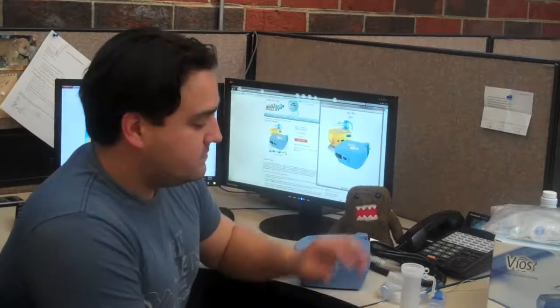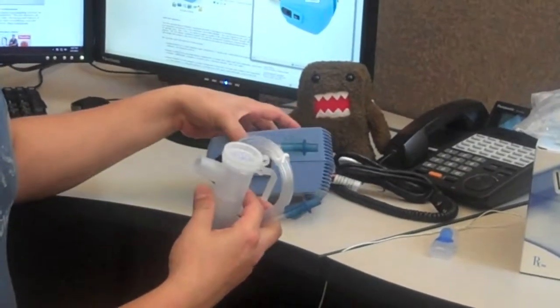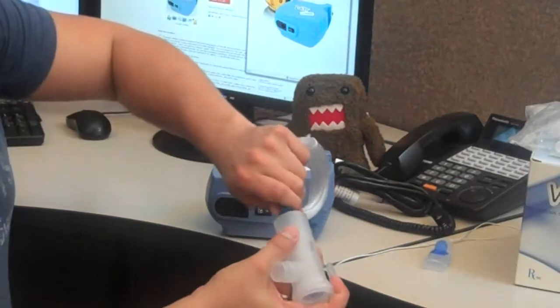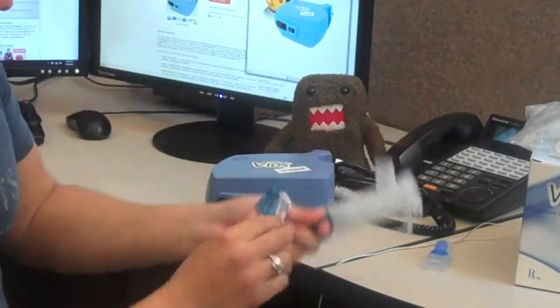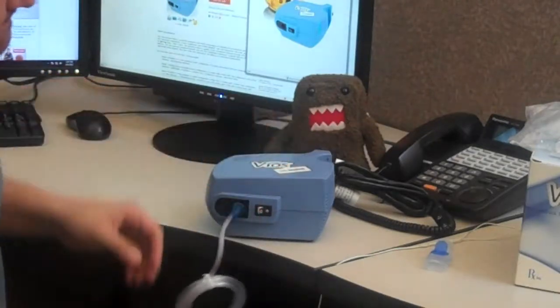It's actually very simple. The neb cup is your included hose and the vios. All you do is simply attach to the bottom, twist to get on, do the same with the vios, and now you're set.